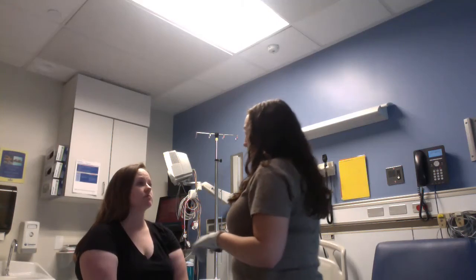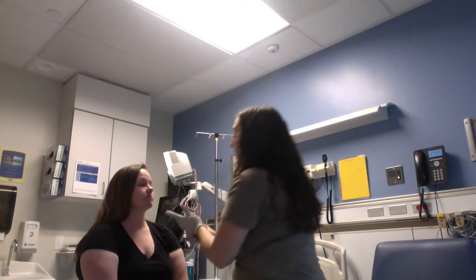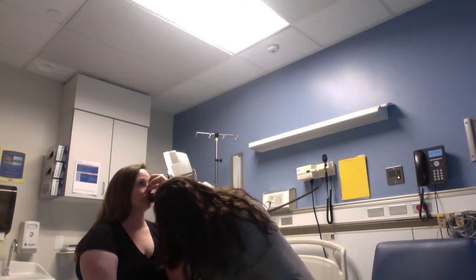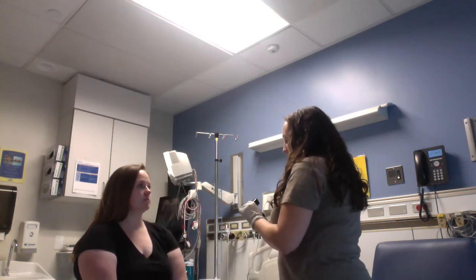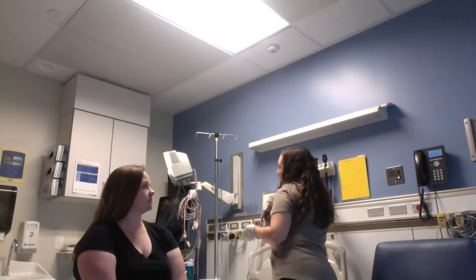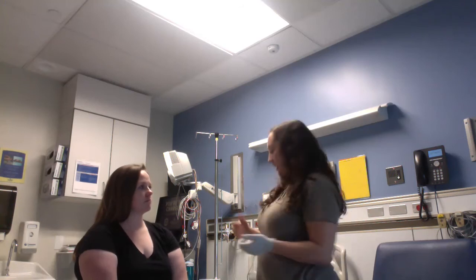And with this, we're also checking for nasal deviation, or septal deviation, excuse me. And with that, we want to make sure that there's not any abnormal discharge, and we want to be really careful when placing it in the patient's nose, as we don't want to strike a blood vessel and cause them to have a bloody nose.